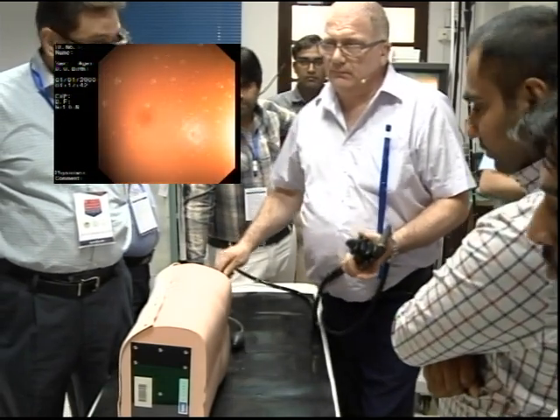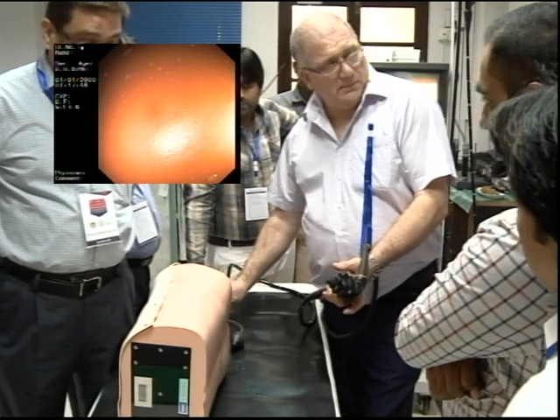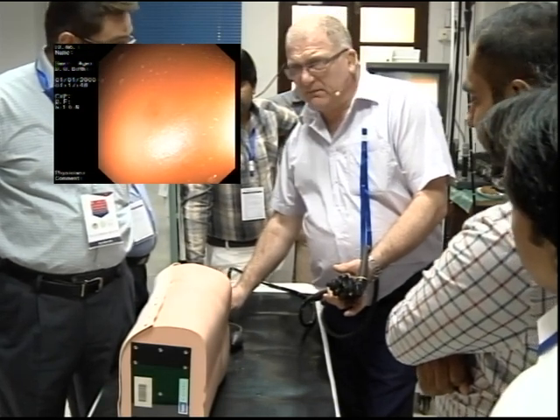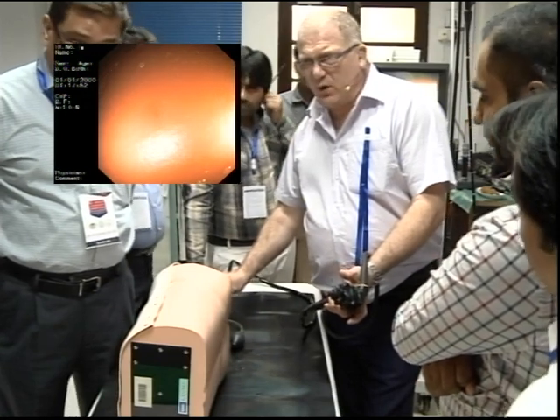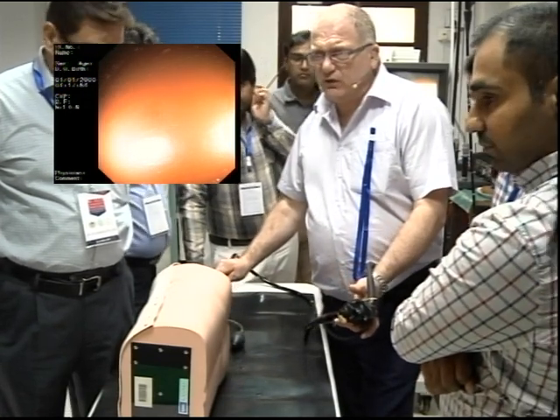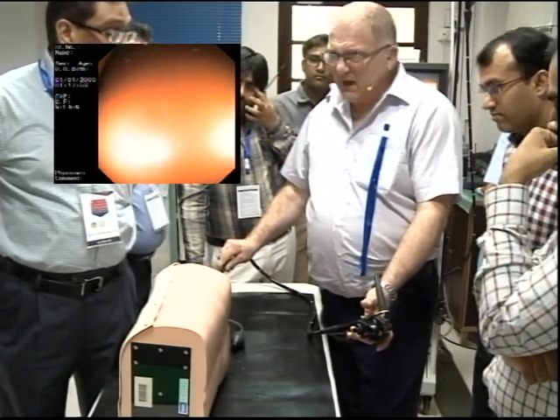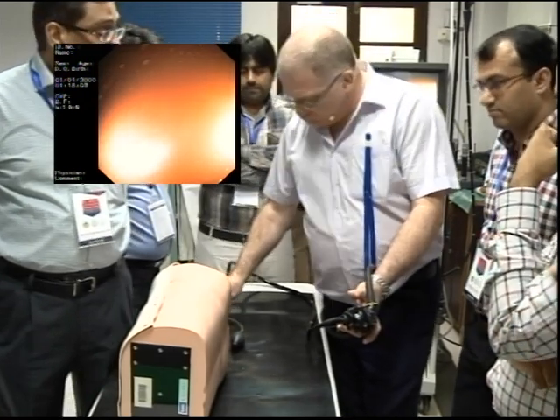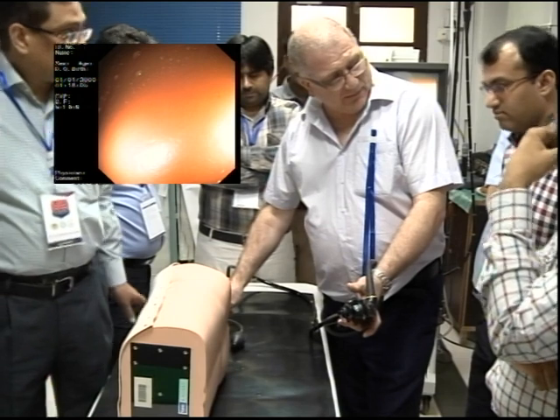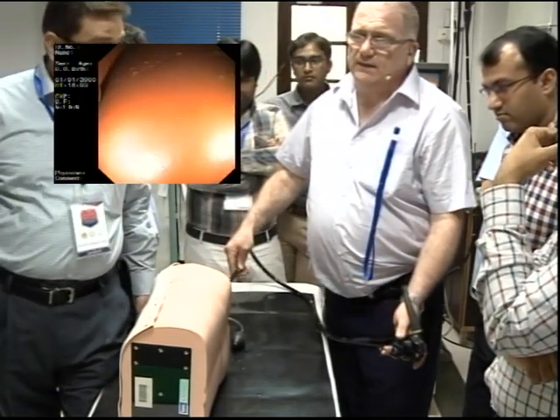This is what you're doing at the moment. You can't apply torque — the hand is down. You bring the scope. Watch what it does on the screen. If you bring the scope up into a straight position, the torque is now coming on the scope. Did you see that? If I put the scope down, the torque is coming off. You've got the scope pushing down here. This is why you've got to keep the scope in a straight line going into the patient.